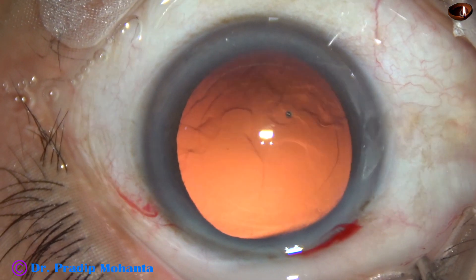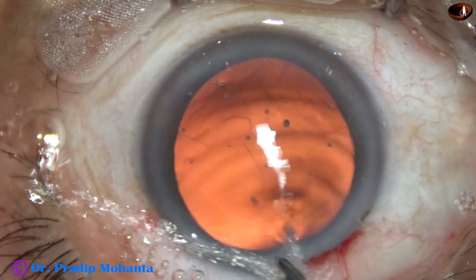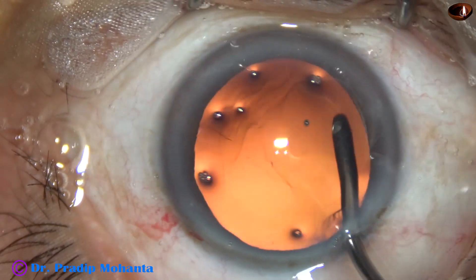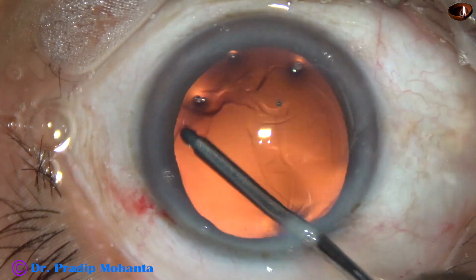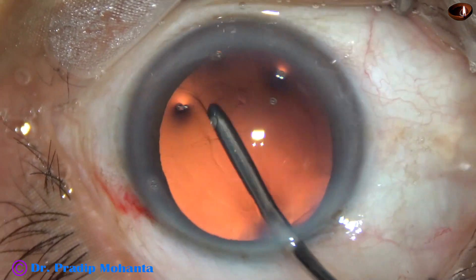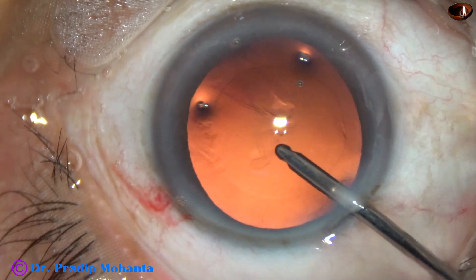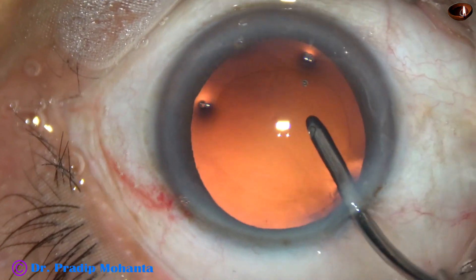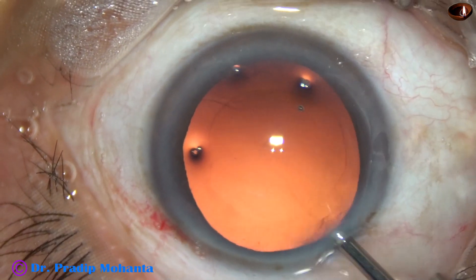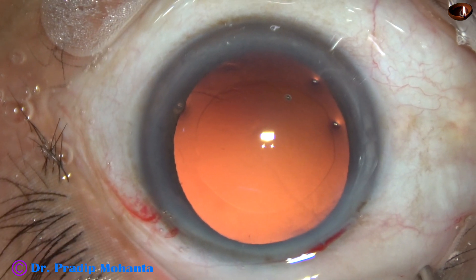Going through the only side port on the left side. And now I take the irrigating probe of bimanual irrigation aspiration and use this irrigating jet of fluid to polish the posterior capsule. Whatever cells are there, they get dislodged by this maneuver, and a clean posterior capsule is achieved.